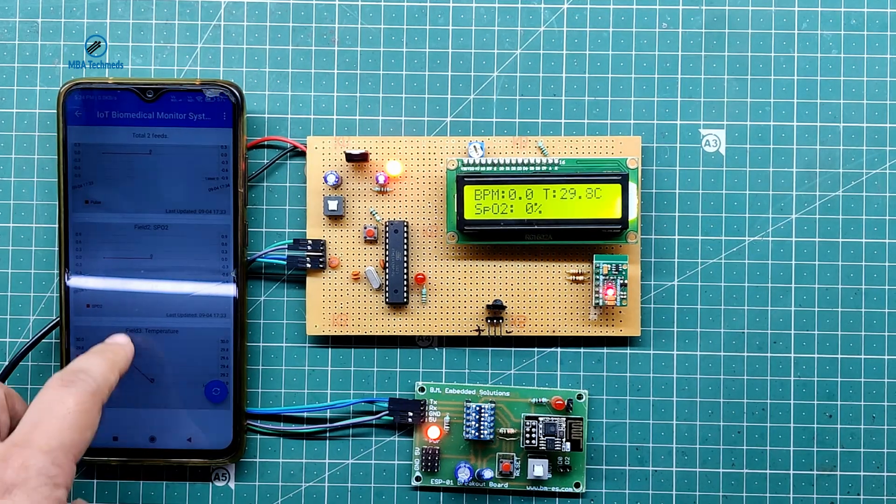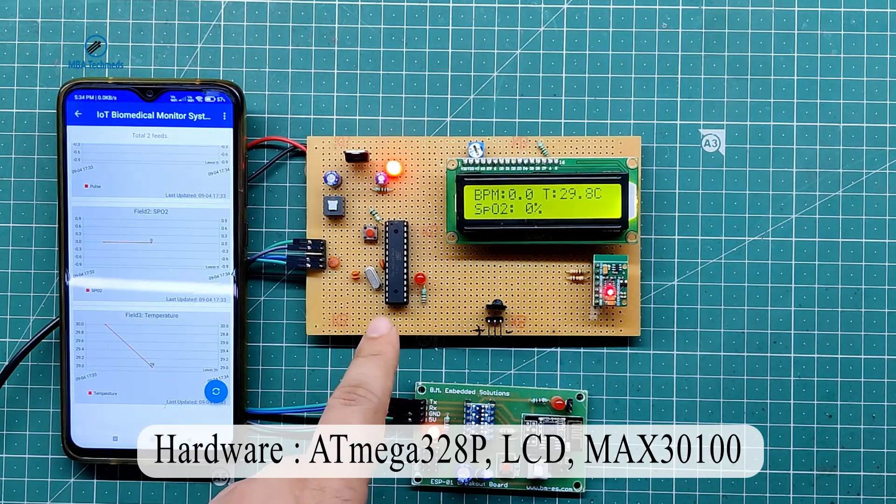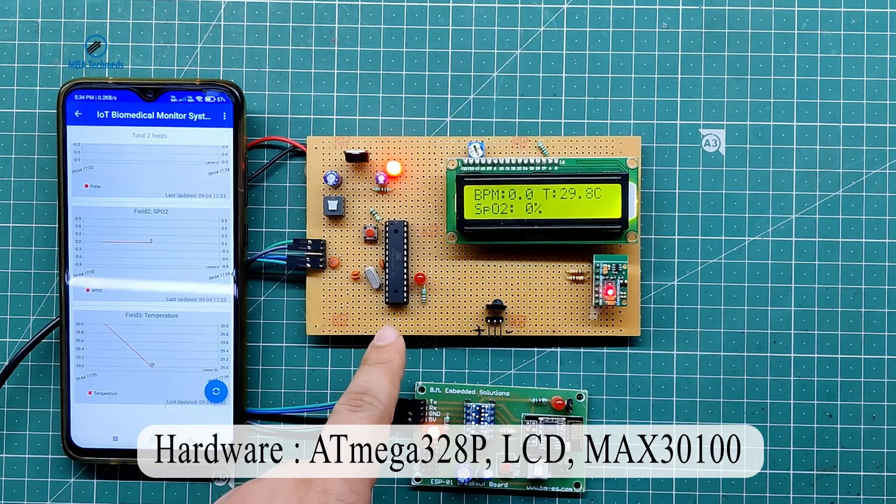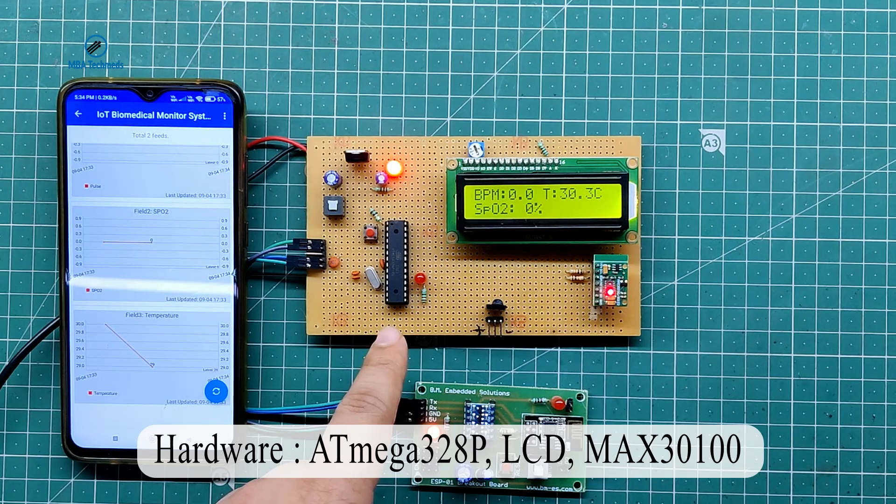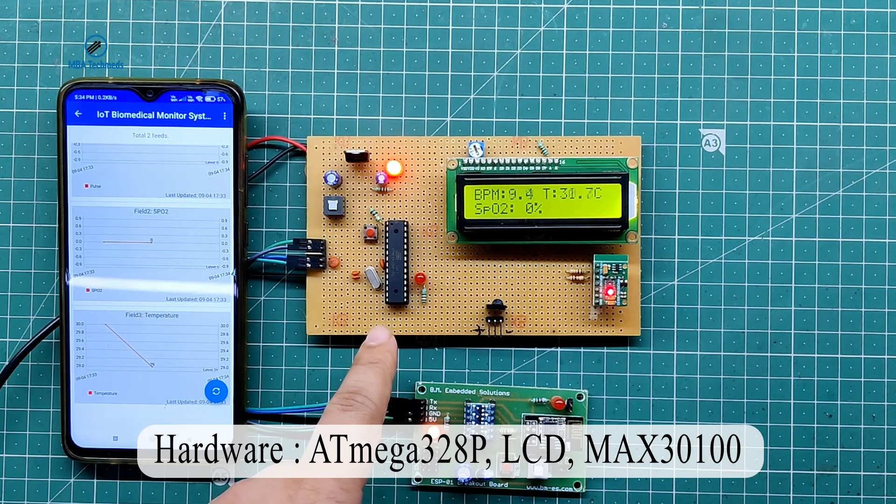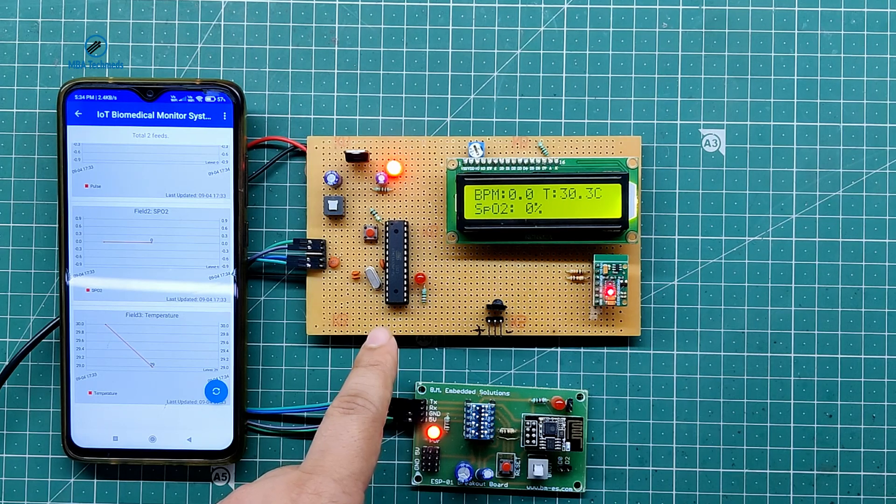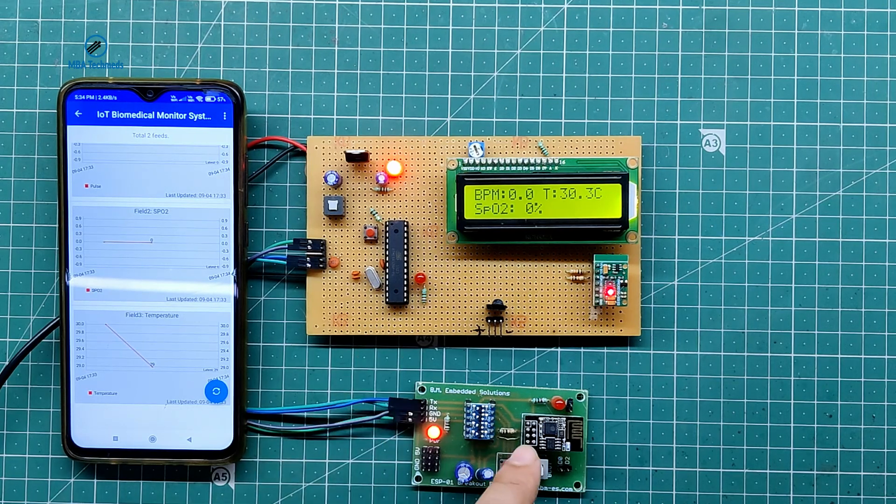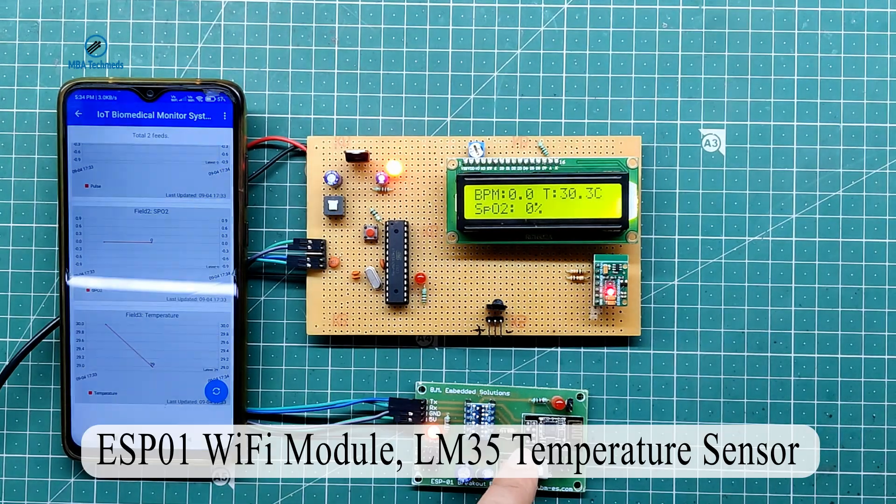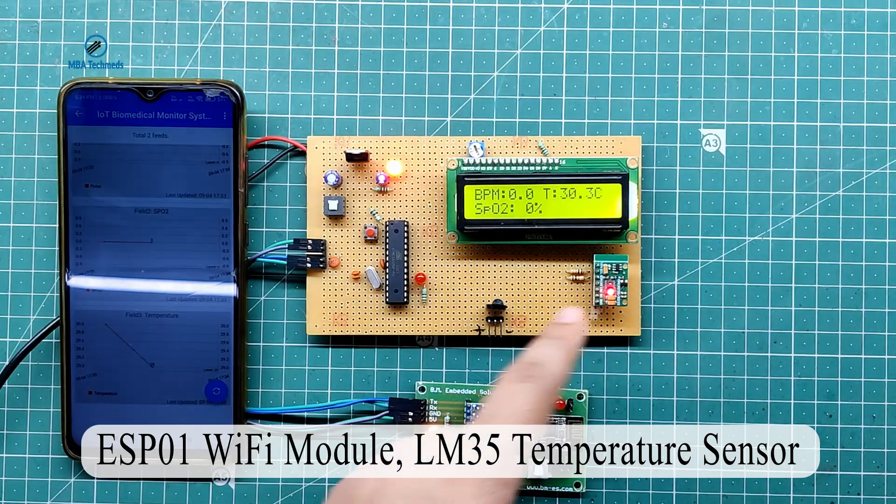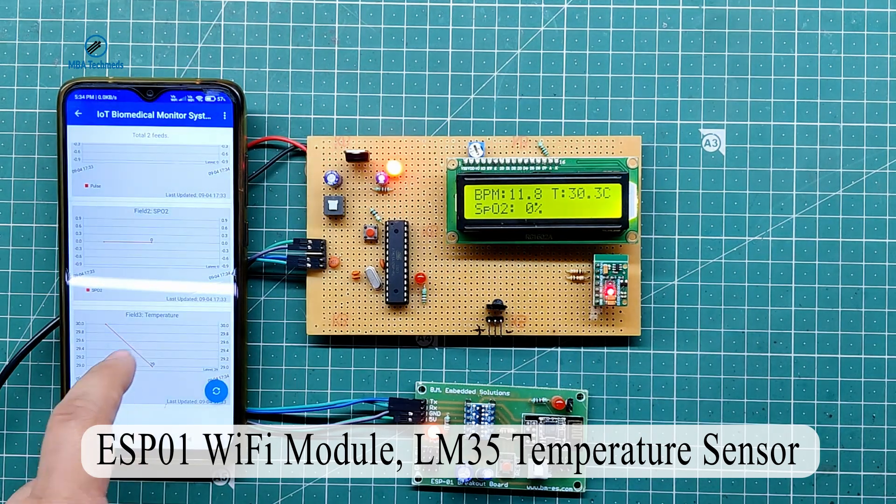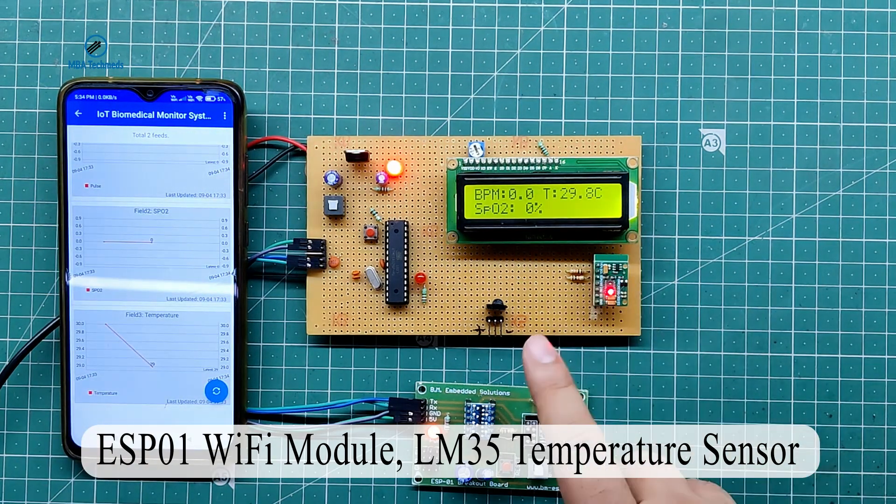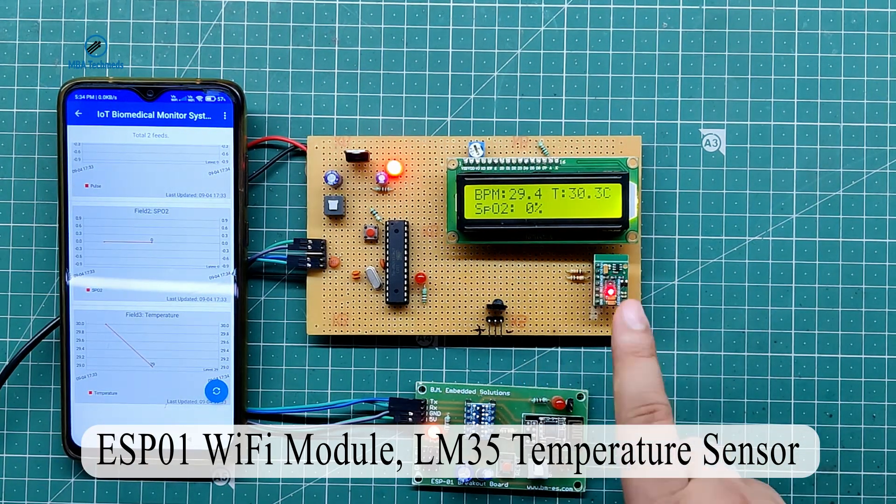I will talk about the hardware first. This is based on ATmega 328p and programming is done in Arduino, ESP01 WiFi module, MAX 30100, Pulse Sensor, LCD, and LM35 Temperature Sensor.